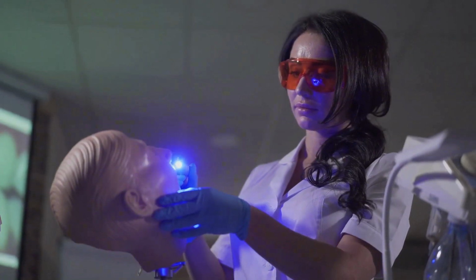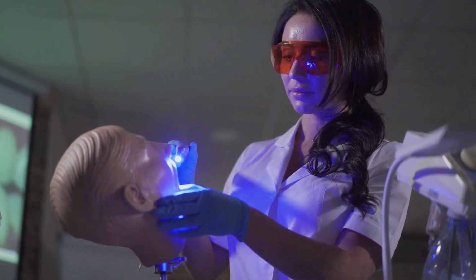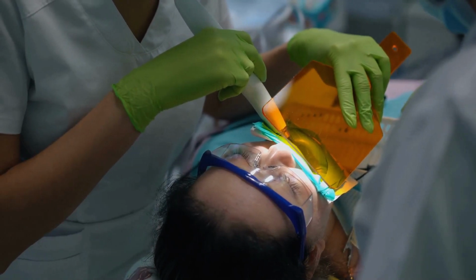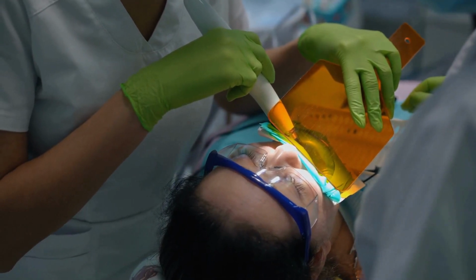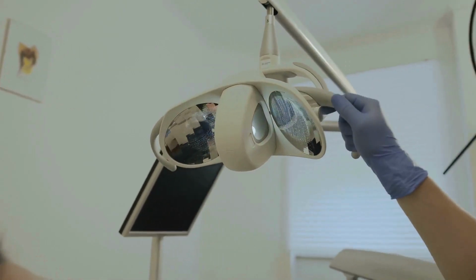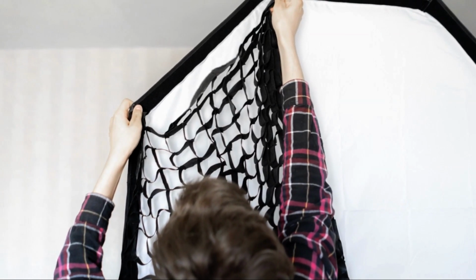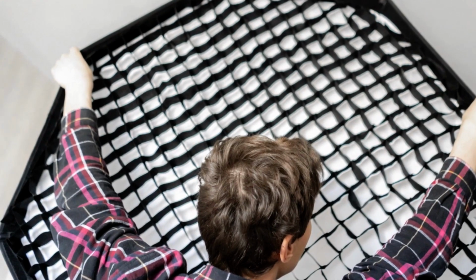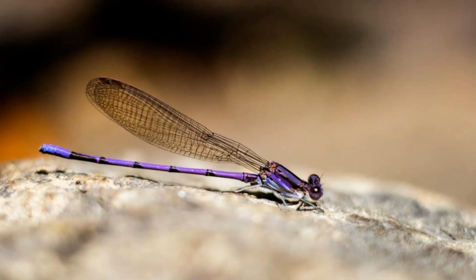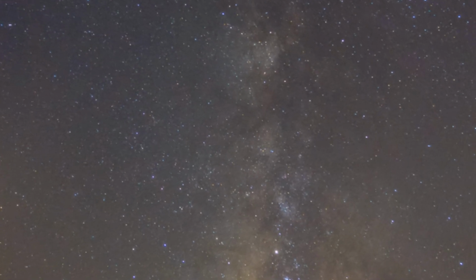Another challenge is achieving consistent exposure across the image, especially when dealing with the highly reflective surfaces of teeth. This can lead to overexposed highlights or underexposed shadows, affecting the overall image quality. To overcome this, use a light source that provides even illumination, such as a ring light or a twin flash system. Adjust your camera settings, such as aperture, shutter speed, and ISO, to achieve a balanced exposure.